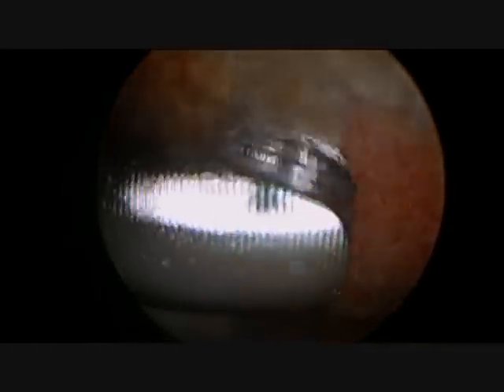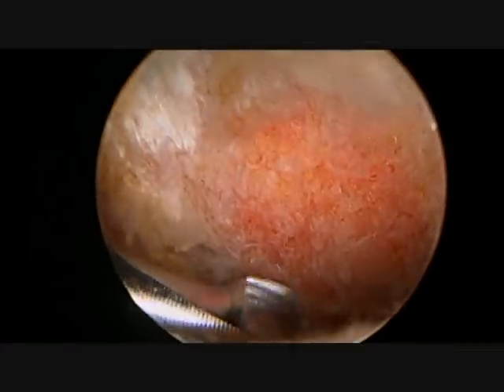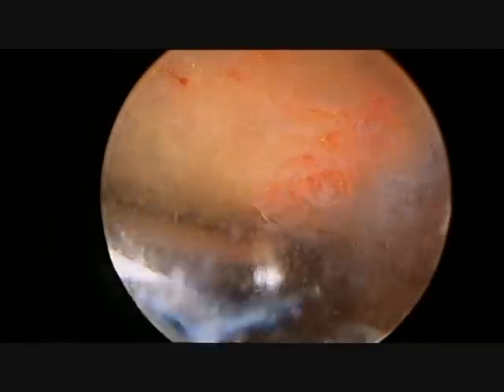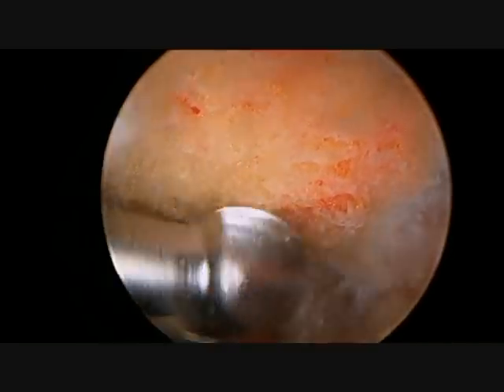It is important to remove a sufficient amount of bone from the front and side of the acromium and ensure that there are no rough edges on the undersurface which could potentially cause pain. Here we can clearly see that the bone spur has been completely removed. The decompression is then evaluated to assure that there is no residual pressure on the rotator cuff.